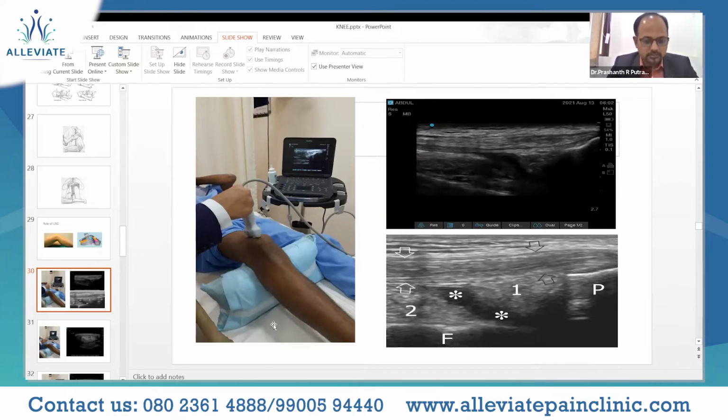The person performing the scan and the screen should be at a straight angle, so there should not be any torsion of the neck. Okay, and as I told, you place a pillow beneath the popliteal fossa so that you have a flexion of 20 to 30 degrees, and then the protocol of the knee starts with the suprapatellar area, where you place a linear probe.